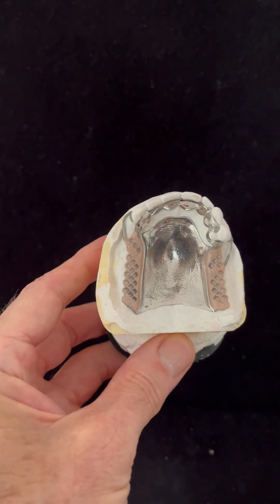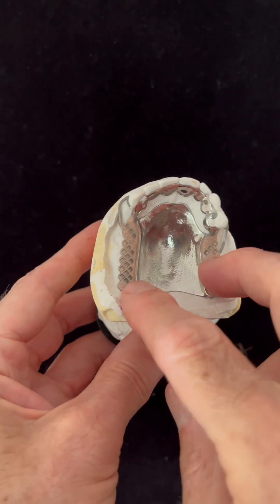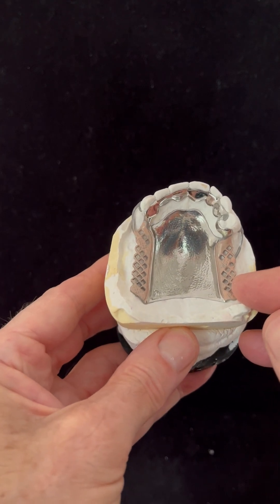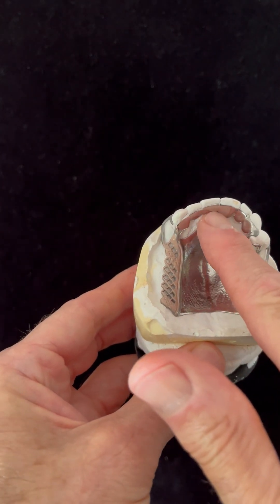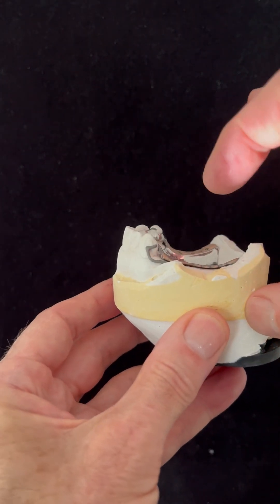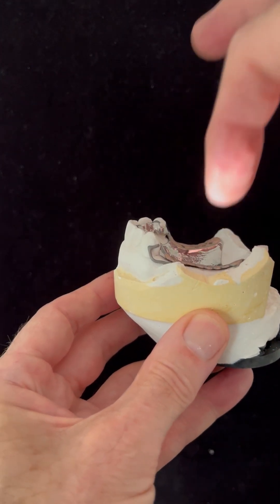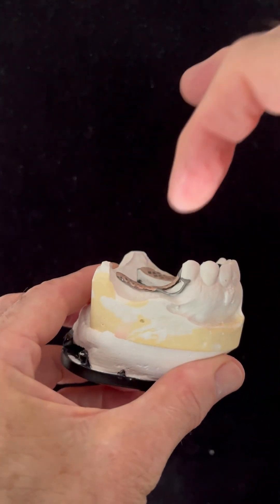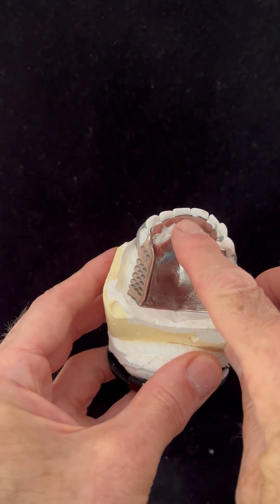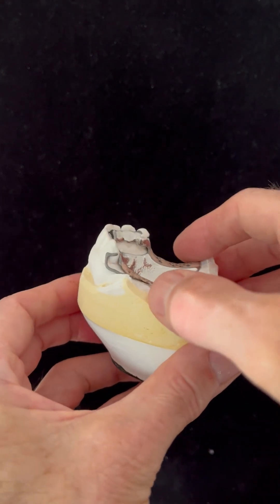Let's talk about a case here — a bilateral free-end saddle. It was suggested my design was not quite correct and that we should have placed rests to load the teeth. My argument is that occlusal loads on this denture are going to act through the teeth on the denture base and to the alveolar ridge, resulting in vertical loading through the alveolar ridge. There is no vertical loading in the anterior part of the denture — the anterior part is for indirect retention.